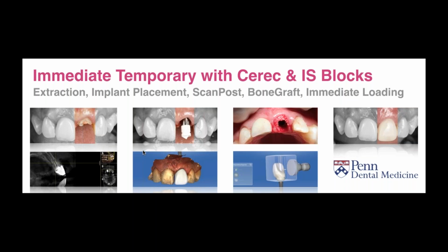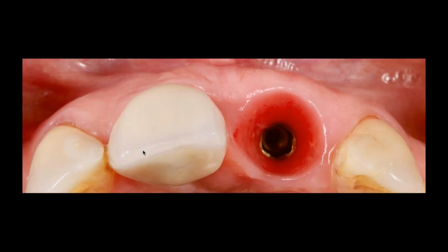And then I came back to Costa Rica, I think a year later, and the patient said, you know, I'm going to maintain this crown as my final crown, so I need to start changing the way that I charge for these ones probably, because we see that we don't expect any changes in the soft tissues. Why? Because we are using the time for the osseointegration parallel to obtaining the best soft tissue maturation surrounding this polished hybrid ceramic material.